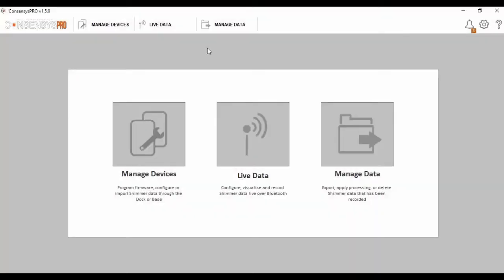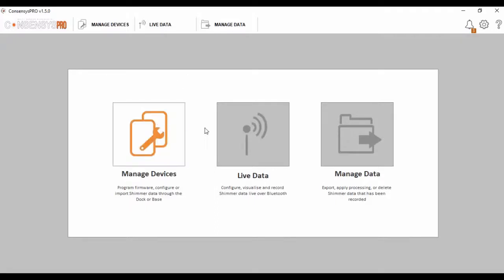We are now going to focus our attention on our consensus software application. For the purposes of this exercise, I am using the consensus pro version of this software. When you start the application, you are presented with three core tabs: Manage devices, live data, and manage data.